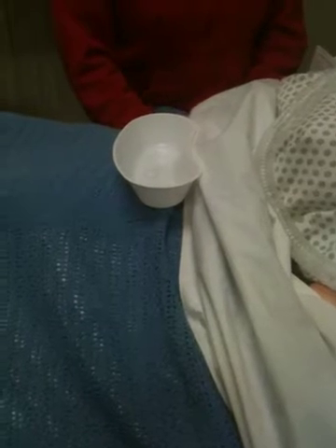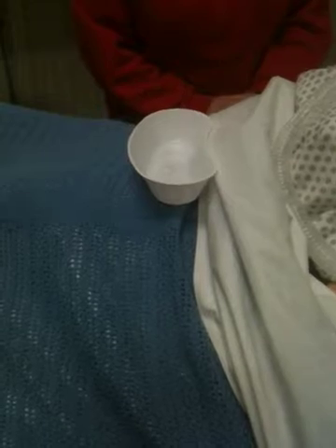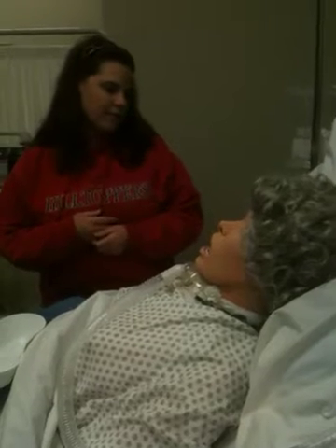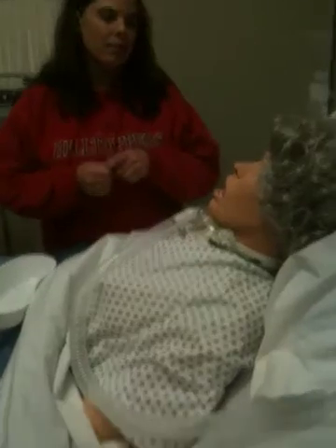I want the patient to relax and breathe normally. It's very important that I ask about any injuries. 'Ms. Olsen, have you had any facial trauma, ever broke your nose or anything like that?' She said no. I also ask about sinus surgery, because if they have had a deviated septum I would want to stay away from that nare. Next I'm going to put my gloves on.